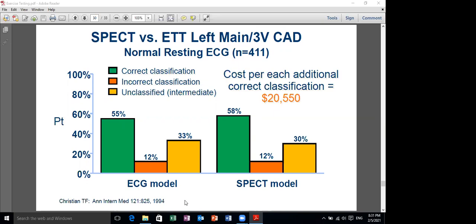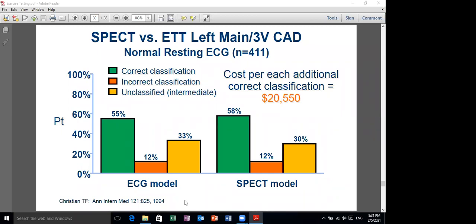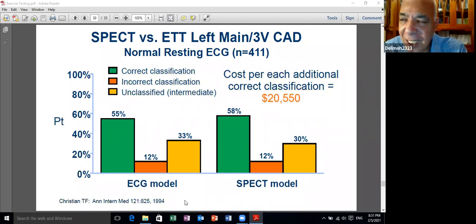محمود امين خد مني السؤال، الاكس واي زد ليدز دي بنحطهم ازاي؟ الاكس واي زد دي كانت ليها قصه، الاسم بتاعنا مشهور بيها لان كانت من رساله نبيل الشريف. نبيل الشريف دي يعني الارتوجنال ليدز دي كانت بتتعمل انها بيتعمل صندوق.